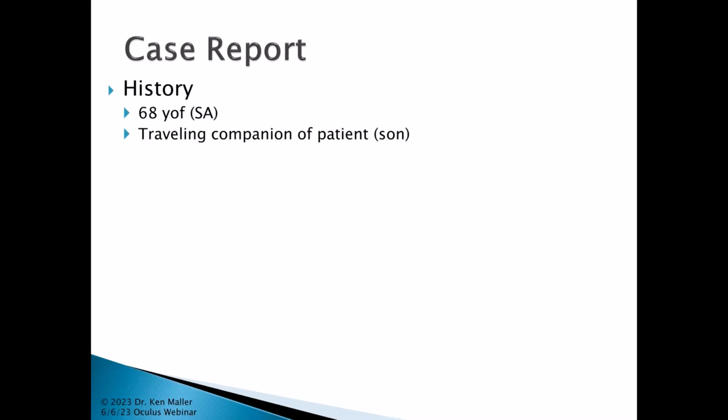Okay, so let's take a look at the case report now that we understand why we'll run into some capture problems. And let's take a look at the history of this particular patient that I chose to present to you tonight. This is a 68-year-old female. Her name is S.A. And she was actually a traveling companion of the patient.